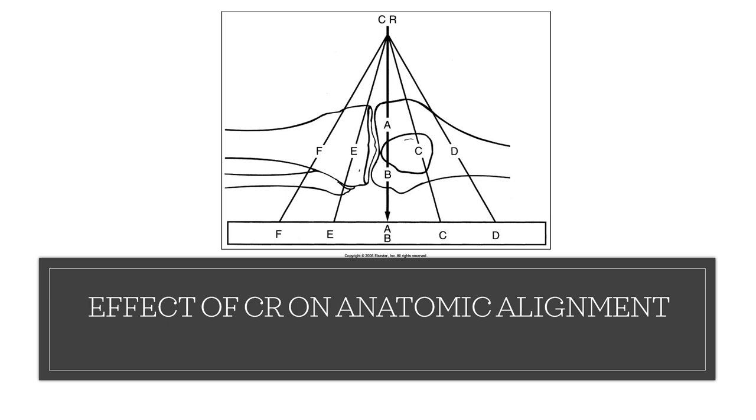Is this CR correct? No. As you can see, the beam is traveling a little bit superior to the joint, so it will close off the joint.